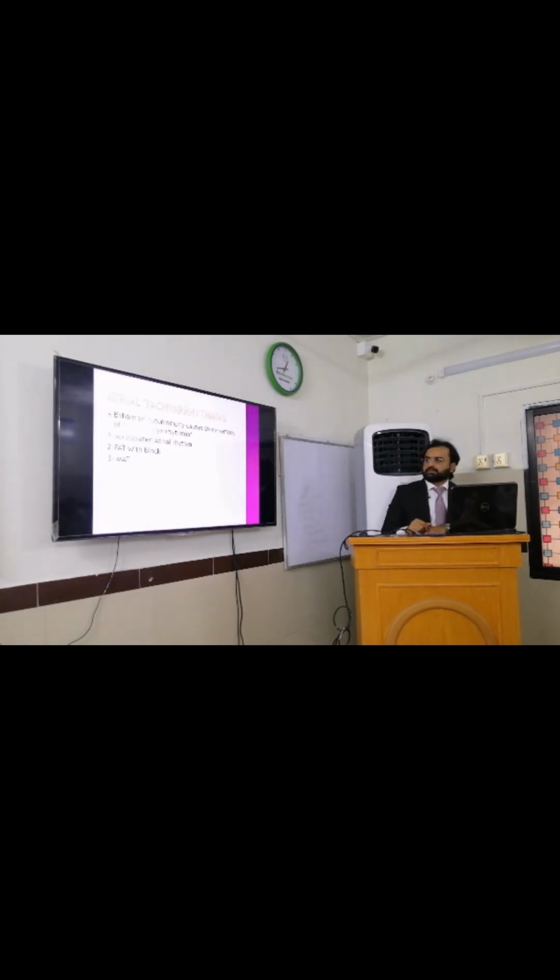So we will talk about certain ECG abnormalities, abnormal rhythms, right? Our topic of discussion today is atrial tachyarrhythmias. When we talk about tachyarrhythmias, it means there's a disruption of the heart rate, there's a rise in the heart rate, and it is going to be abnormal, right?